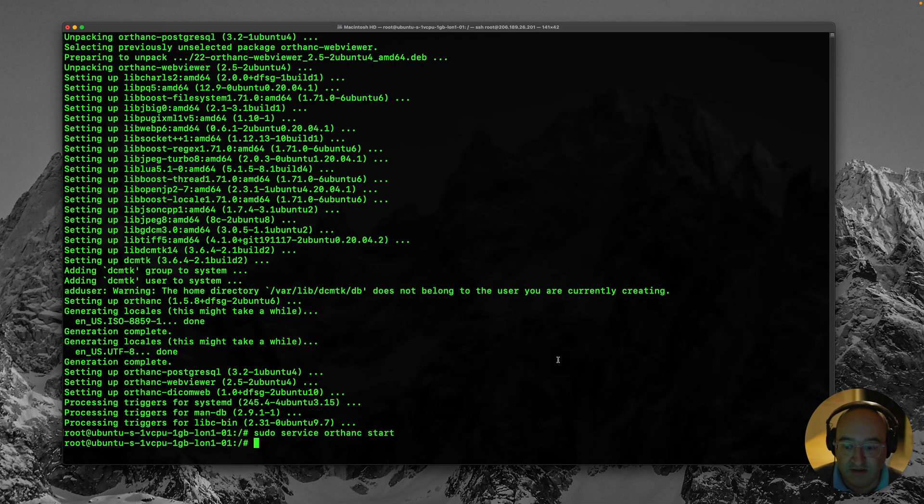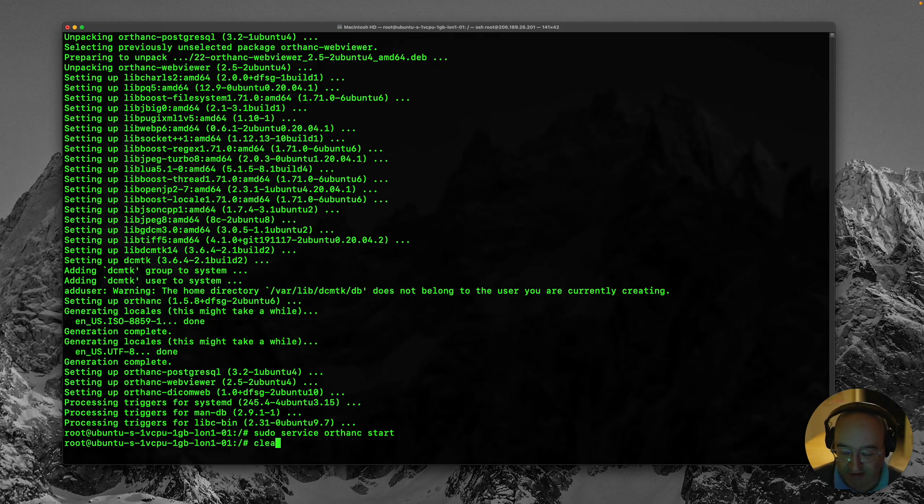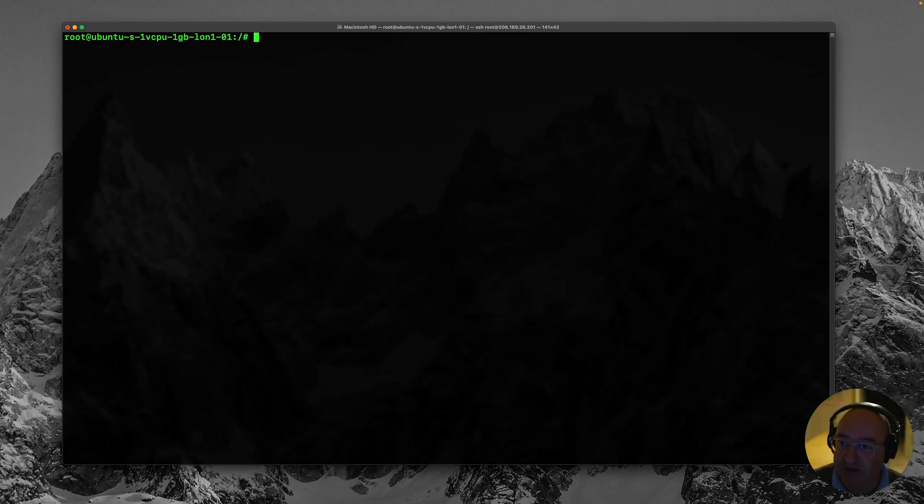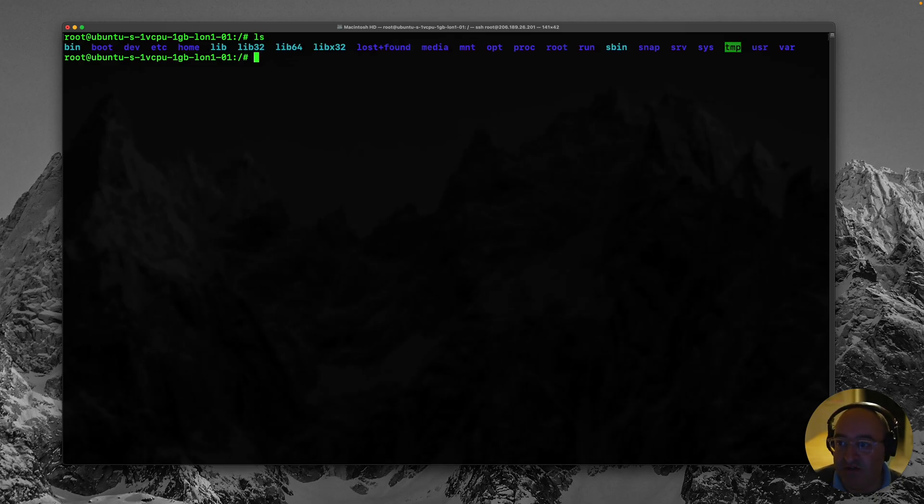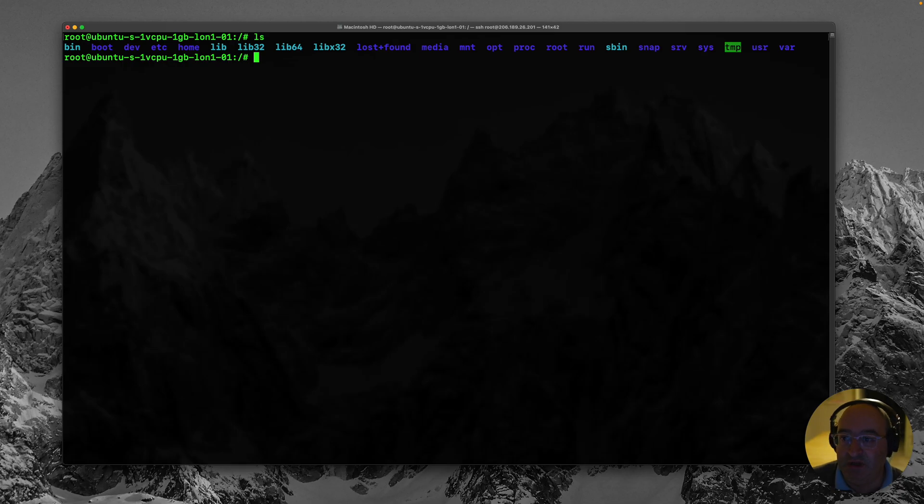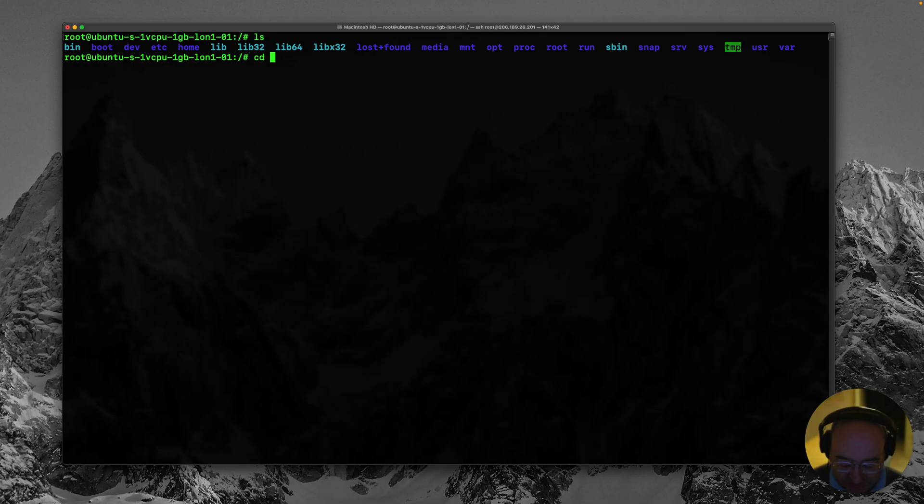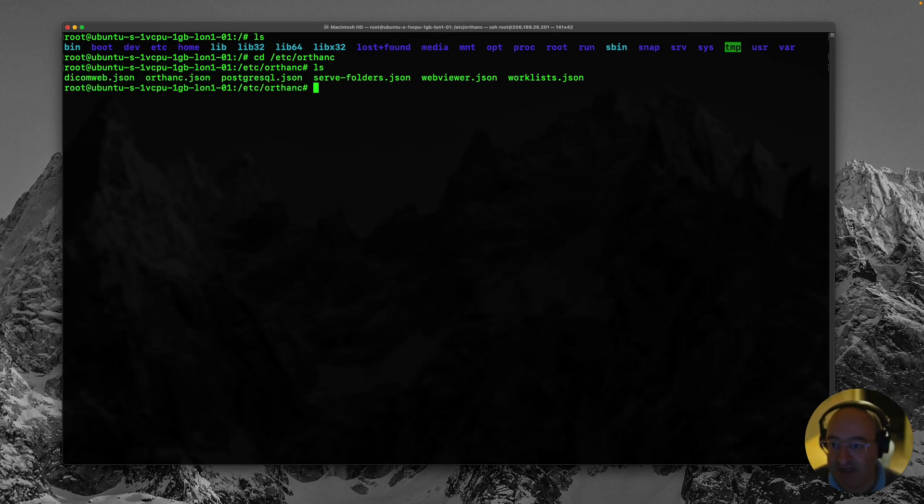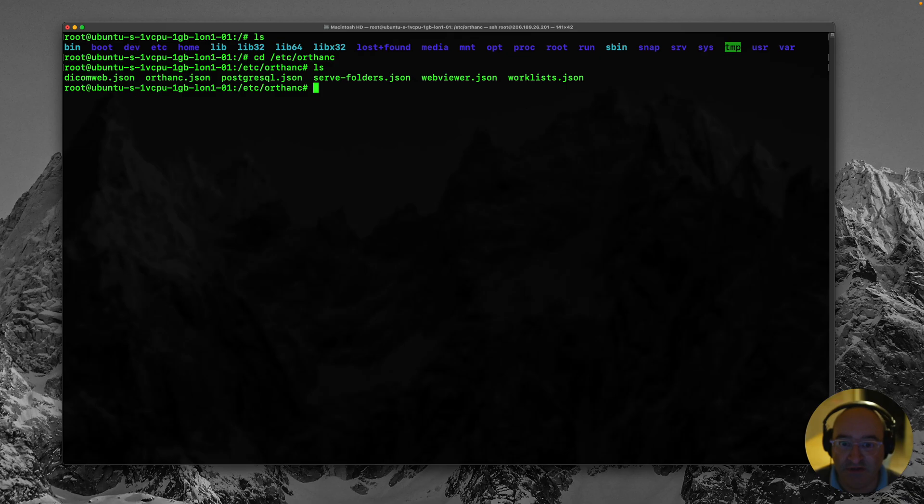So I'm back over here in the terminal and I'm just going to type clear to give a bit of a blank screen. Next I'll type ls so that we can see where we are. And I am going to type cd which is change directory /etc/Orthanc and hit ls again and we'll see that we're in a folder with lots of json files.